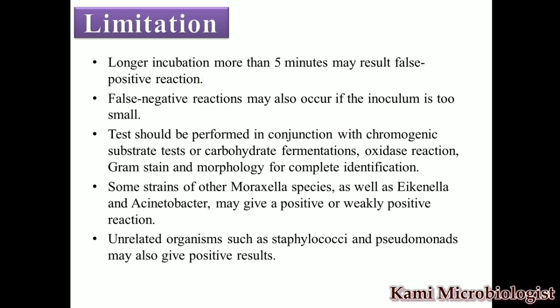Remember, if we provide longer incubation, it will give a false positive result. That's really important, so within 5 minutes the result will be observed. Next, sometimes we get a false negative result due to a small inoculum, so we have to take heavy inoculum to get a correct positive result.